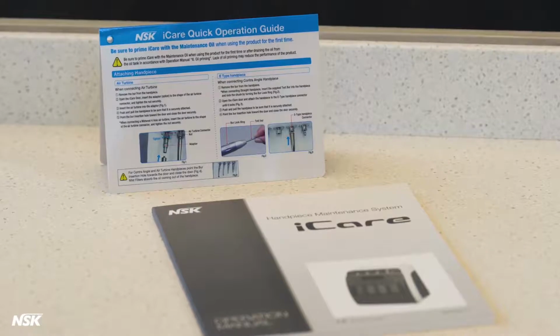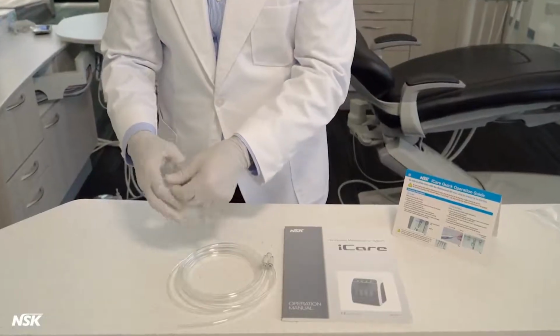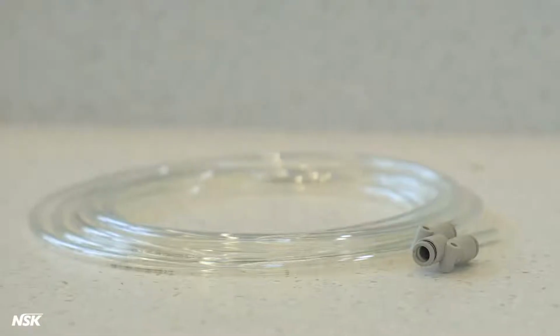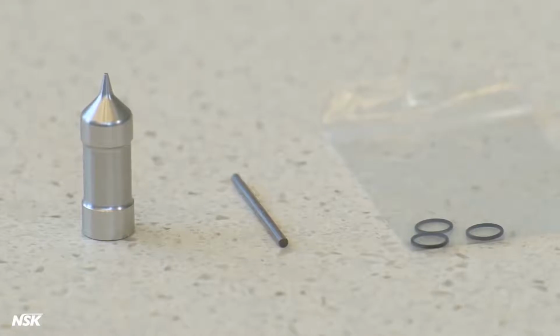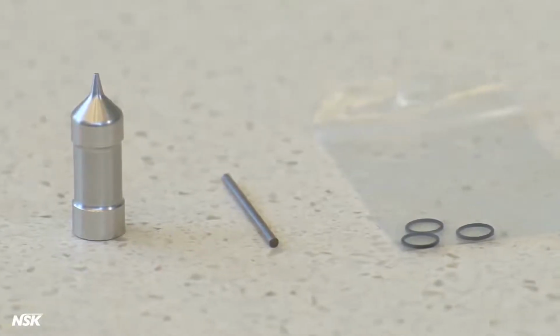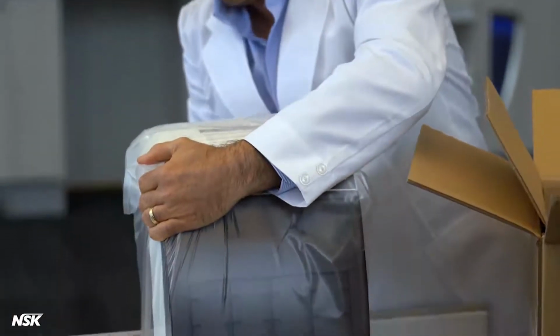Inside the box, you'll find the operation manual with the Quick Start Guide. Inside the plastic bag, you'll find several important pieces: 1/4-inch air tube, chuck cleaning nozzle, O-ring set, test burr. It's also called a dummy burr for straight nose cones. Next, you'll find the iCare unit.